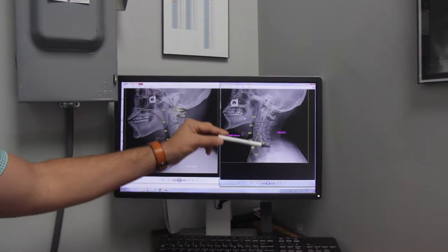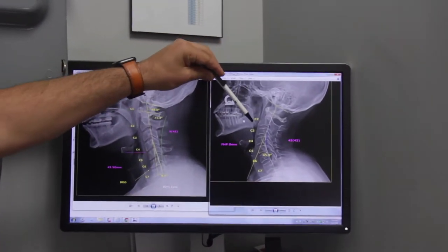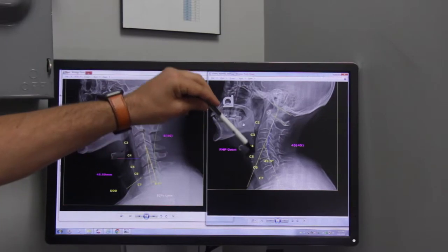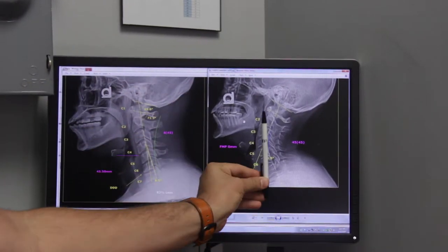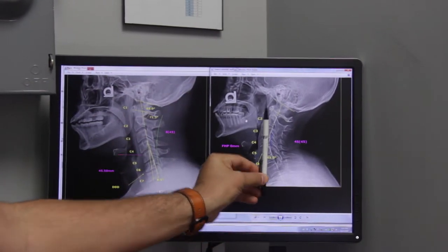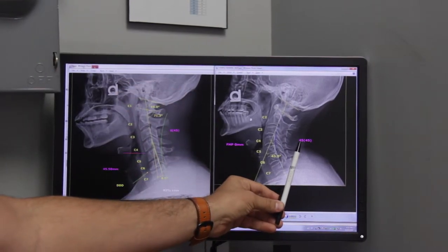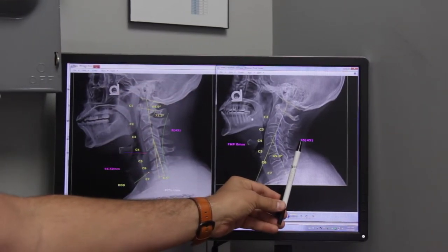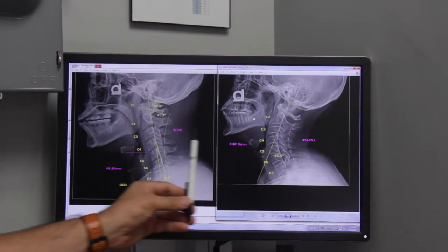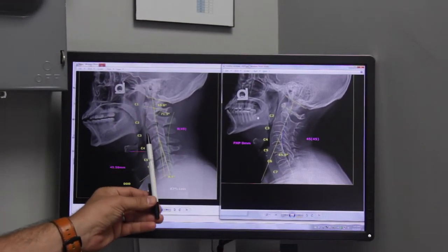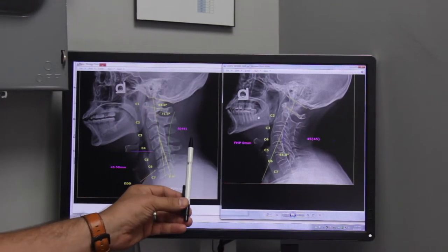You'll notice in the sample x-ray, one of the major features we look at is the overall curvature of the spine. When you're looking at the side presentation, it shouldn't be vertical and straight — it should actually have this arc, with the ideal position being 45 degrees. This person measured 45 out of 45. Over here, you'll notice this person has straightened out; the measurement we got was 8 out of 45.